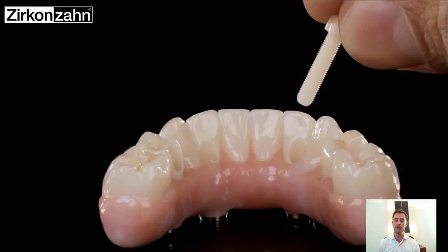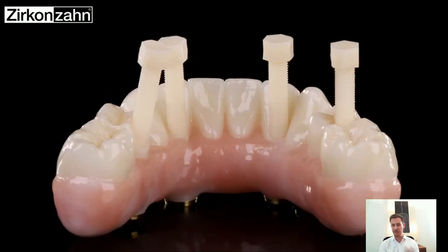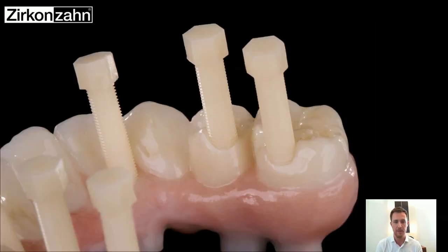So, after screwing the whole restoration onto the implants, the doctor no longer closes the screw channels with composite. Now he just uses those plugs. He just screws them inside the screw channel, the rest of the plug is cut away, and the surface is only polished. They fit very, very well, very tight, so no saliva will go in. You don't have to use Teflon, you don't have to use extra glue or composite, nothing like that.